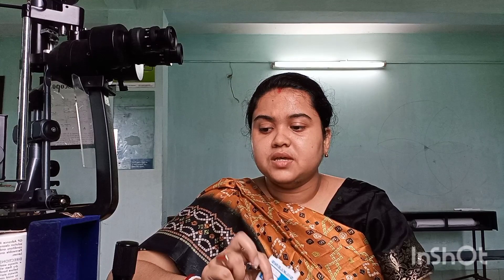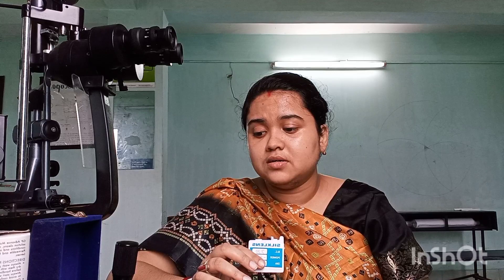From your trial lens set of selected diameters, for normal patients you can use lenses with diameters like 9.00 mm, 9.20 mm, or 10 mm. For keratoconus patients, you need a smaller diameter trial lens. After selecting the base curve, you put the lens on the patient's eye and give the patient time to adjust and blink comfortably.